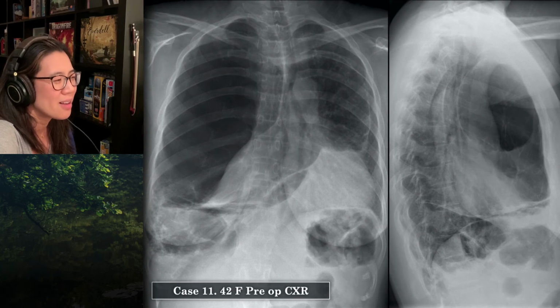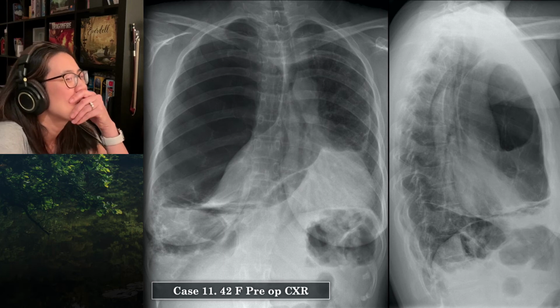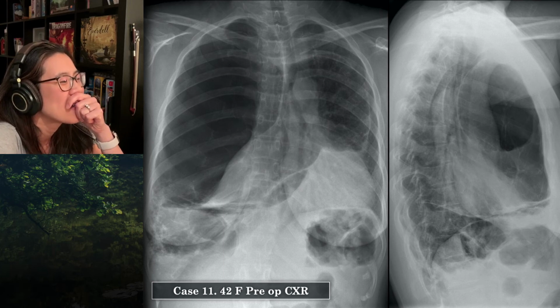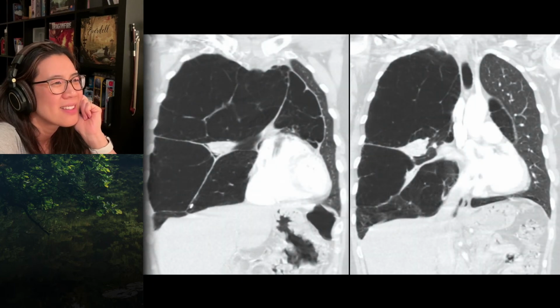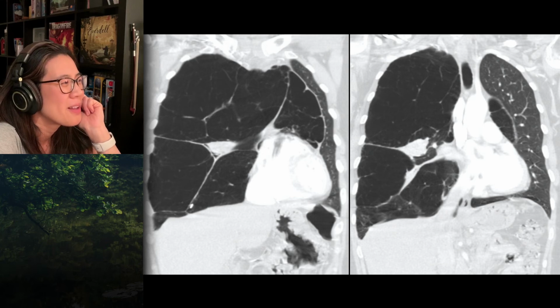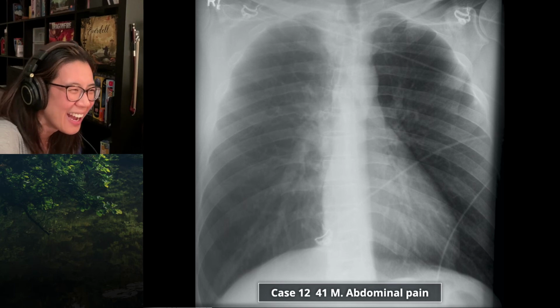I thought initially that was a lobar collapse you're seeing there, or part of a lobar collapse. Wow, that's fascinating. But it was actually part of the upper lobe just squashed down there by this huge cystic lesion. Wow, that is fascinating. Good grief. I thought I'd show you some easy cases. Yeah, thanks. So you could have studied all your life, you would never have got them right.